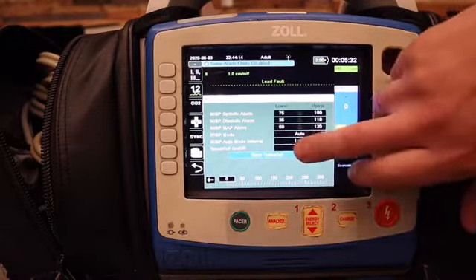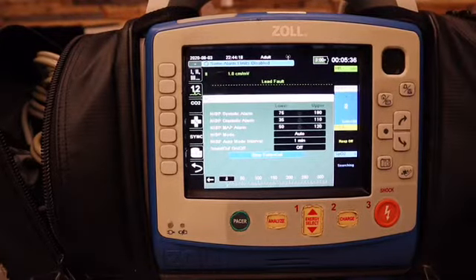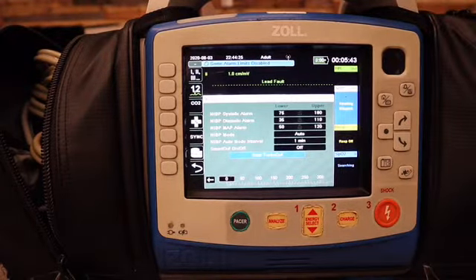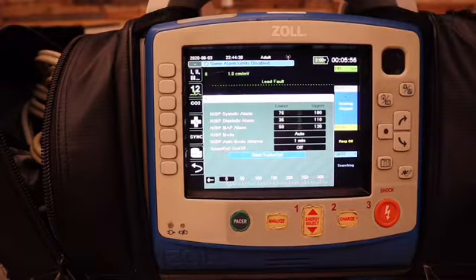The last thing here is called the turbo cuff. You push that and it is going to cycle the blood pressure, and the second it is completed the cuff will deflate. Once it's deflated, it's going to cycle again, and it will keep doing that over and over until you push stop or turn off the monitor.